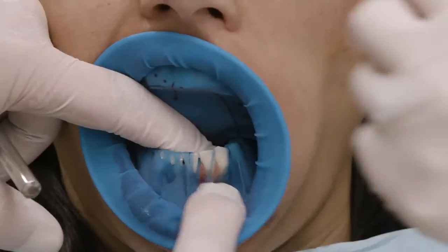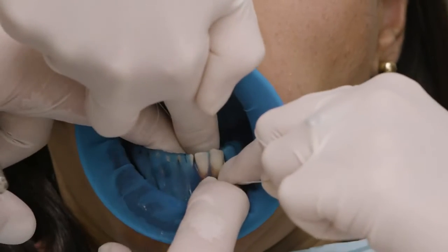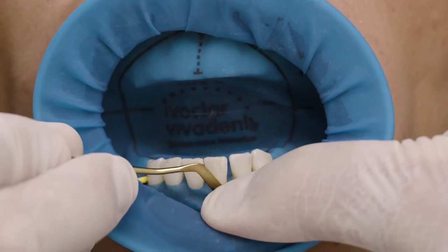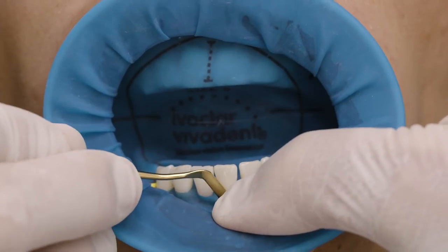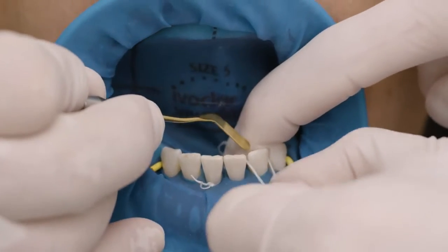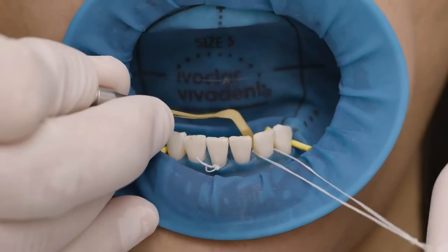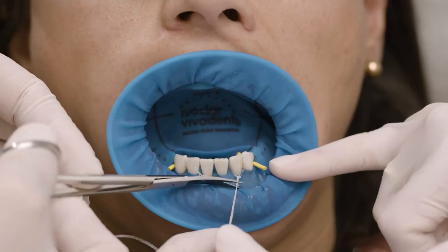Proceed from mesial to distal and use dental floss to overcome the contact point. If necessary, tuck Optradam into the gingival sulcus. By applying ligatures of dental floss, the rubber dam is pulled towards the gum line and fixed, which is important for proper isolation of the cervical area.